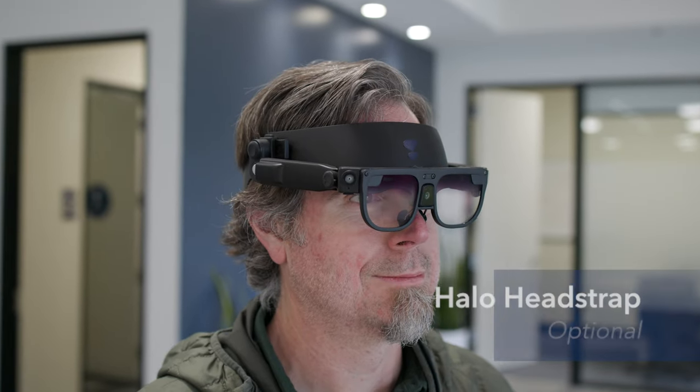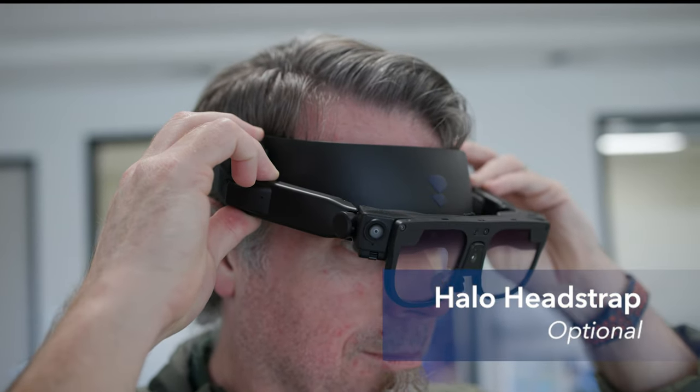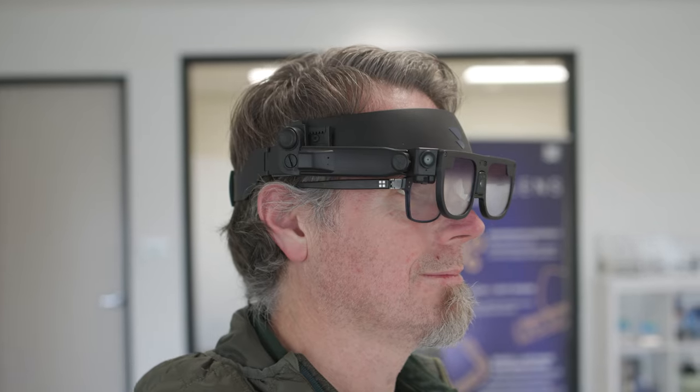For more flexibility, there's the halo head strap. With this, you can clip Argo in and you'll have a full range of motion to move it forwards, backwards, flip it up, and wear prescription glasses underneath.